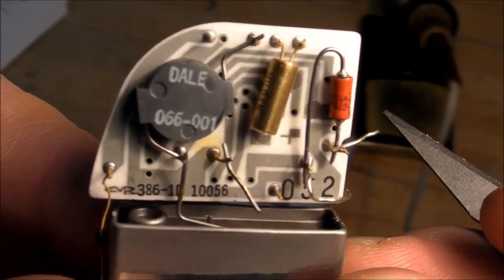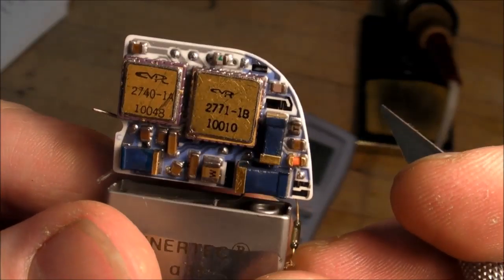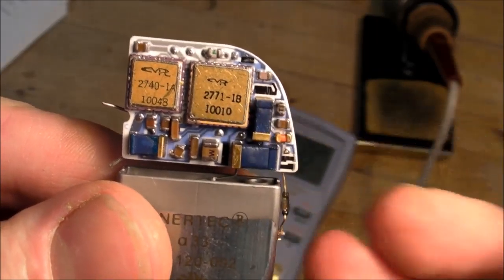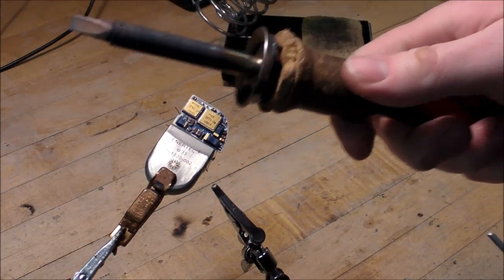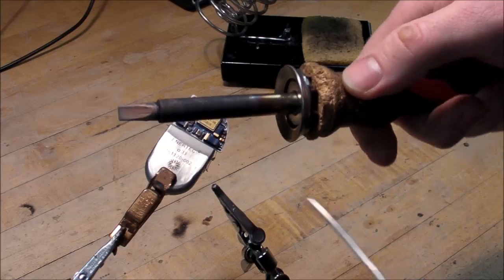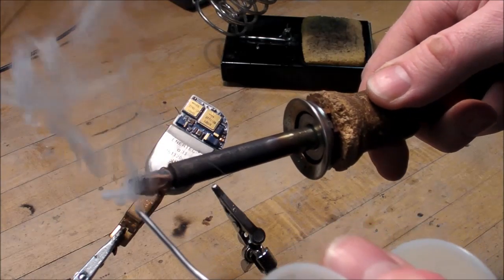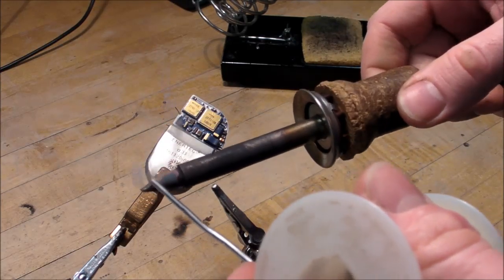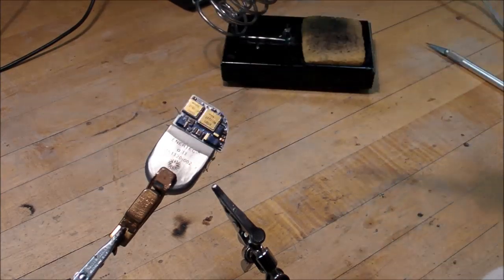Here's a closer look at the other side of the board. So I'm going to use a hefty soldering iron now to try to take these square covers off of the ICs and see what's underneath them. And here's that soldering iron. It's an old school Unger 45 watt soldering iron. It gets really hot, so hot that the flux doesn't really stay liquefied. It just burns off completely in a matter of seconds. So I always gotta solder things really quick with this thing. Sometimes I even have to put it on a variac just to lower the voltage and to reduce the temperature.